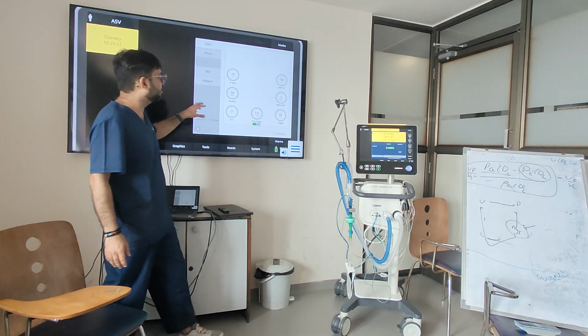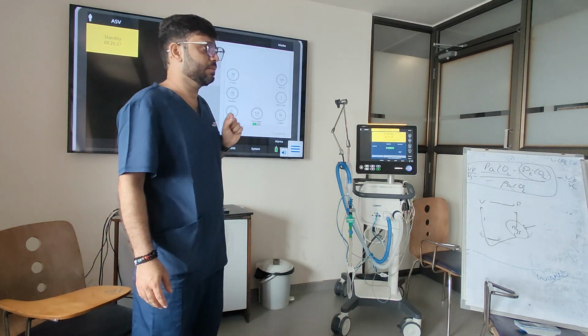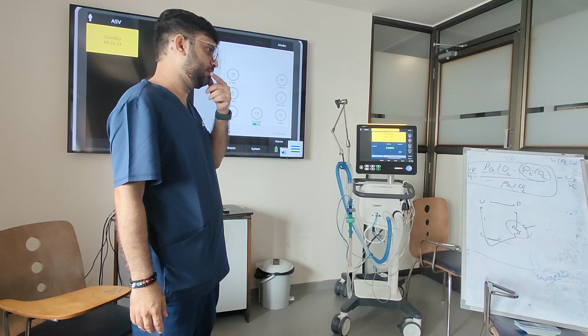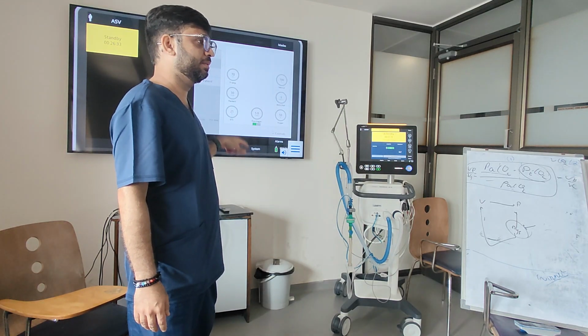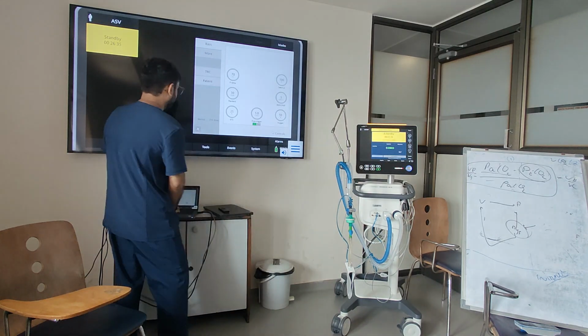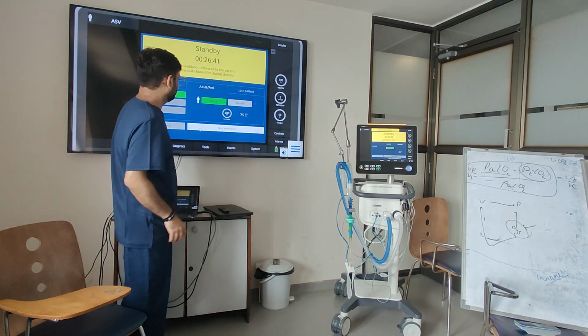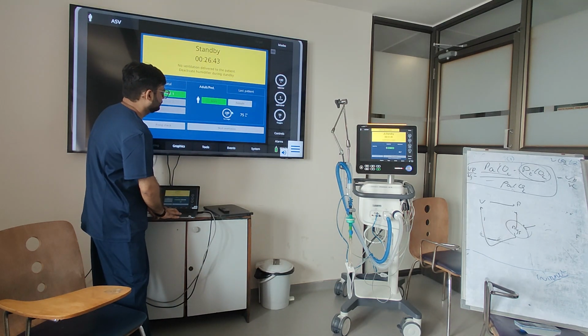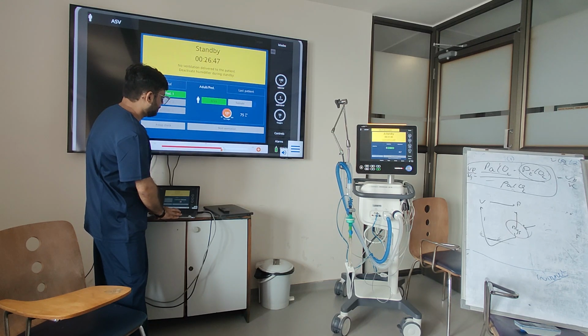Now, suppose, as I said, when you... But what equation is it using for ideal body weight? Because it's not the same equation. What equation is it using? It's the same. No, it's not. I just calculated in my mind. No, you're talking about unfairness. Go by height, centimeters, inches. Even in centimeters it comes to 95.5. I calculated that. So this equation is something different. Because see, if you look at the equation, it comes out different. Whatever it is, it seems to be different.